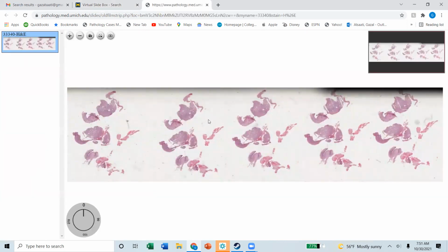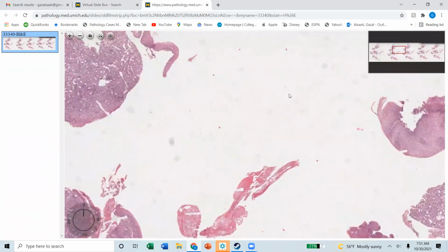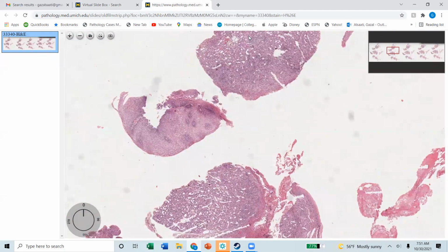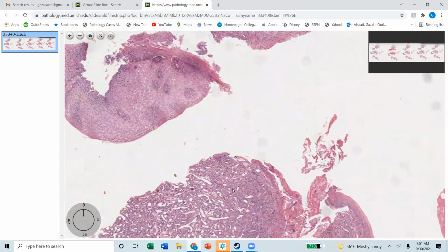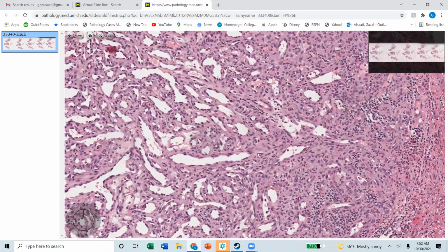Yeah, we missed the hemangioma. Okay, so this is a hemangioma, sorry, the location was esophagus. Oh, very challenging. Because when you have a hemangioma of the esophagus, you want to make sure that you're not missing a vascular tumor, a vascular malignant neoplasm.